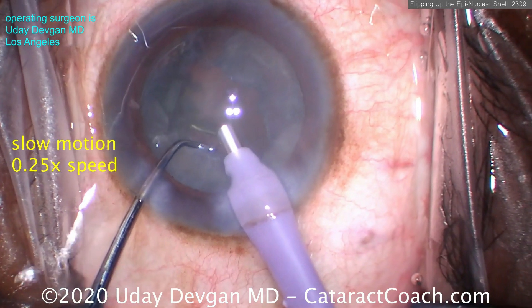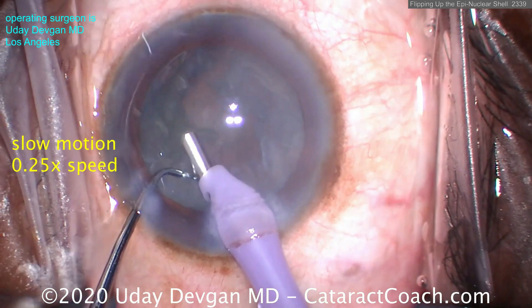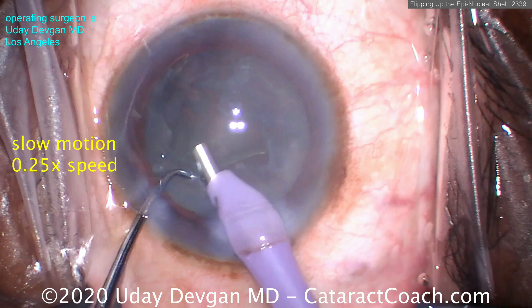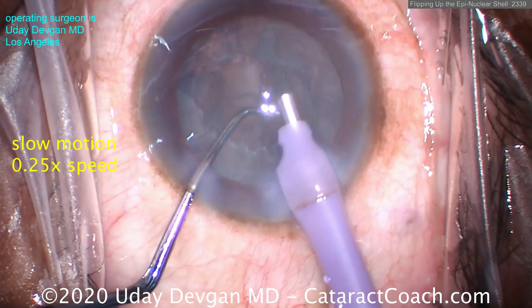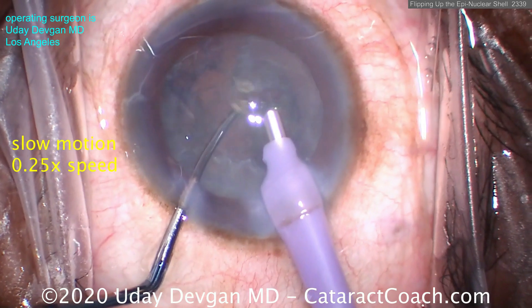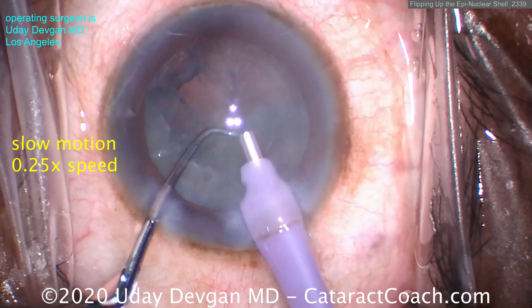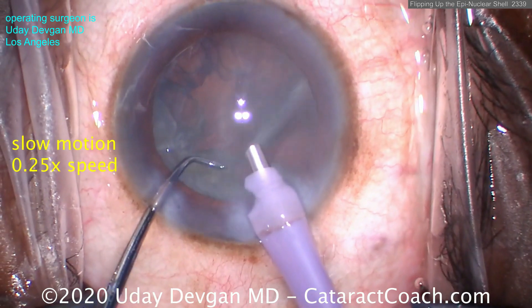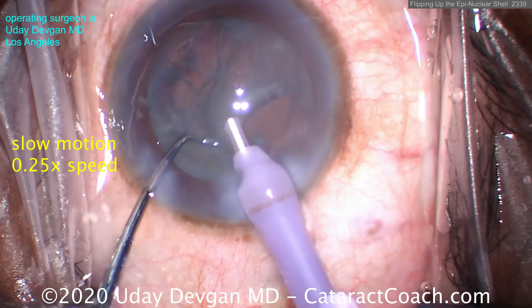With vacuum only — no phaco power, vacuum only — maybe about 400 millimeters of mercury. Nice and easy. If it didn't work on one side, try with the other side. Grab that shell, and as soon as you get a reasonable grab, the chopper is ready in position to flip it over.